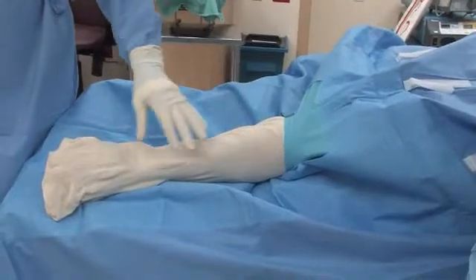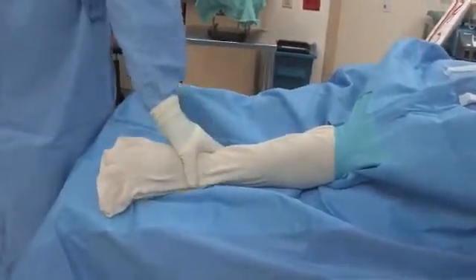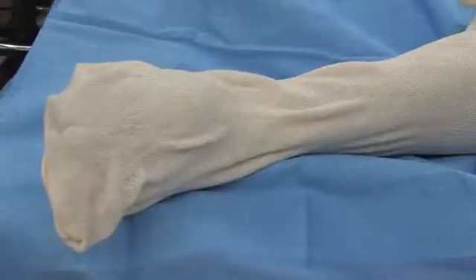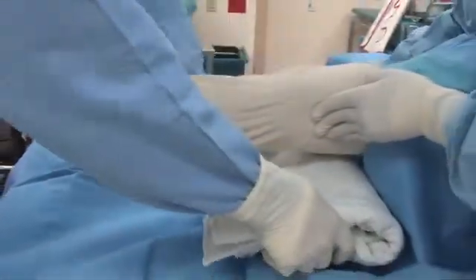And now positioning the foot. I like to use a sterile prep to elevate the foot up off the table. We're going to use a couple of blankets here, fold them in half. This will help with placement of the ring. Go ahead and put that on there.